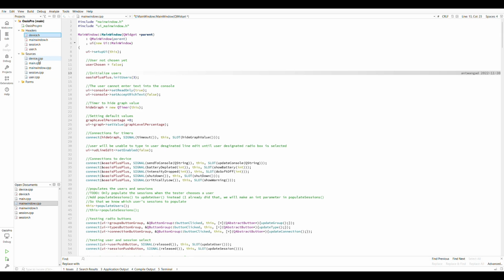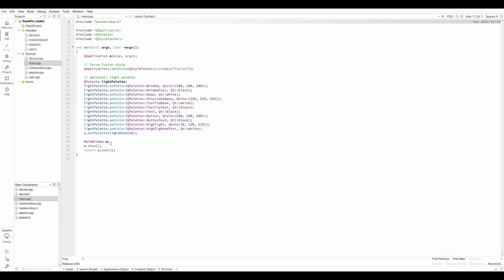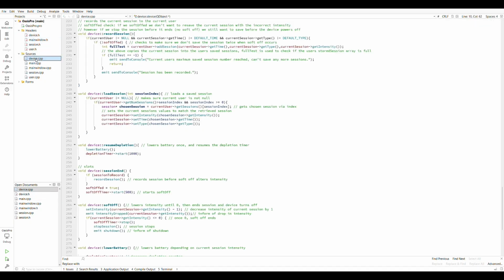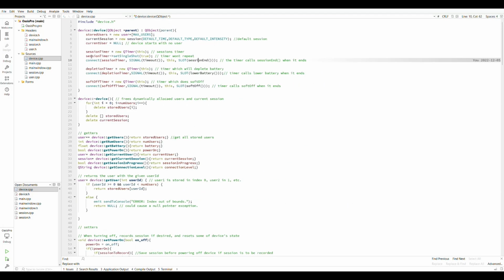So if you'd like, you could go through main window, the header file here, and you can see this is where the actual device is instantiated. So when the constructor for main window is called in main, it will call the constructor for the device, and everything will get initialized with the correct values, like the stored users array will get initialized, the current session will get allocated as well, the timers will get initialized, and everything should work correctly based off of this.